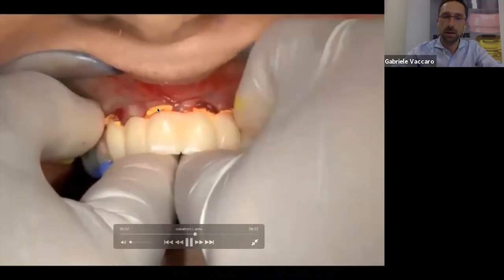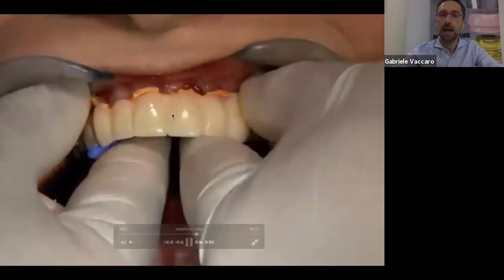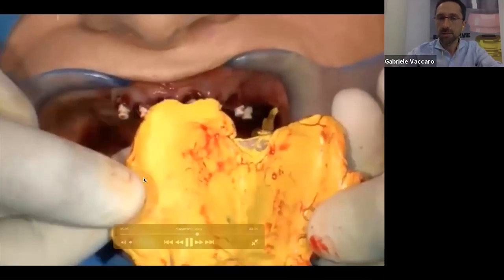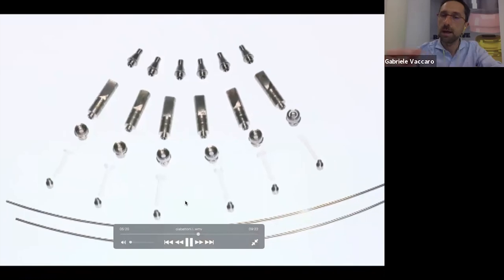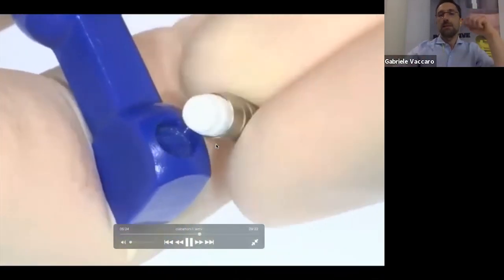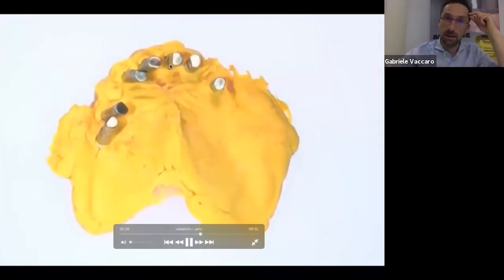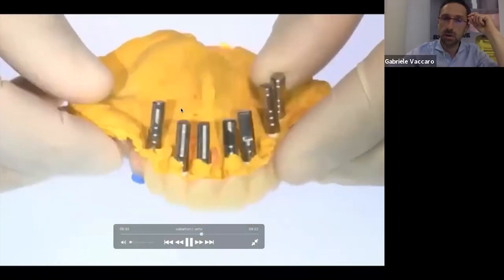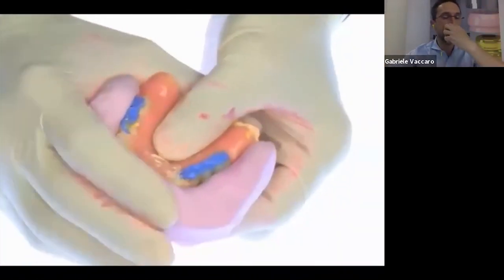After the hardening of the impression material, you need a very strong material, because the analog and the transfer are very low profile, are very short, so you don't have enough mass of material to keep them firmly in position. The transfer and the analog match together, and then you fix it. This I was talking about. You need a very hard material here, because you have to keep them in place perfectly during the prosthetic lab procedure.